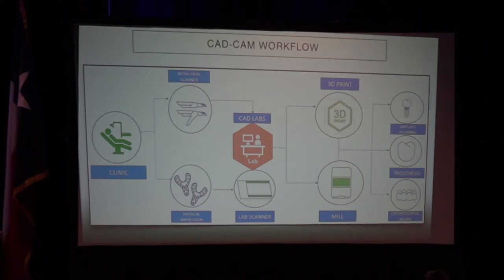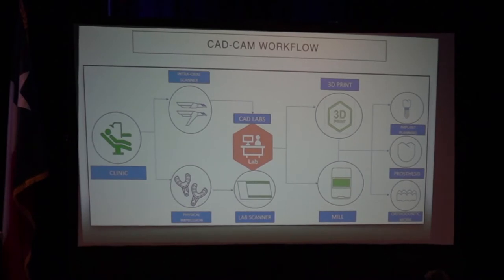So all these things are going on in my head, but let's go back. It's 2021, and I'm still using the same exact Trio scanner from 2017. I've done a lot of cases, all my full arch cases. When I first started, we didn't have an iTero, so I was taking full arch putty and then PVS impressions. You do a couple of those, send it to Invisalign, they say, oh, it's bad. Come back, do another one. And then you get tired of that, and then you start building up volume.